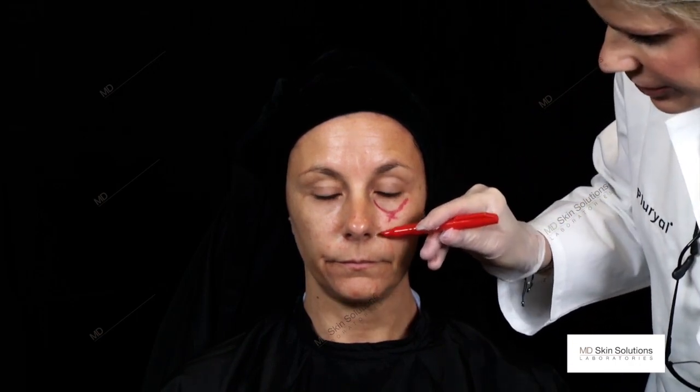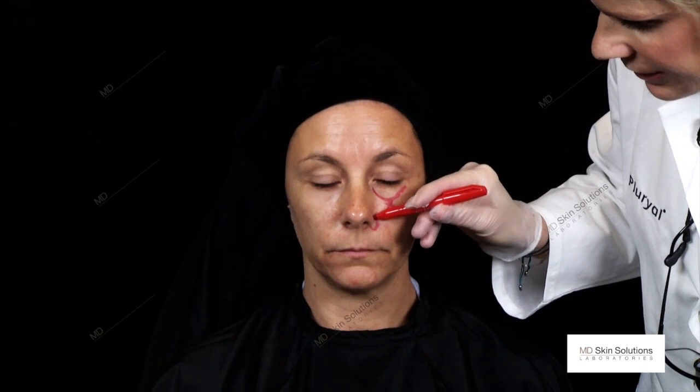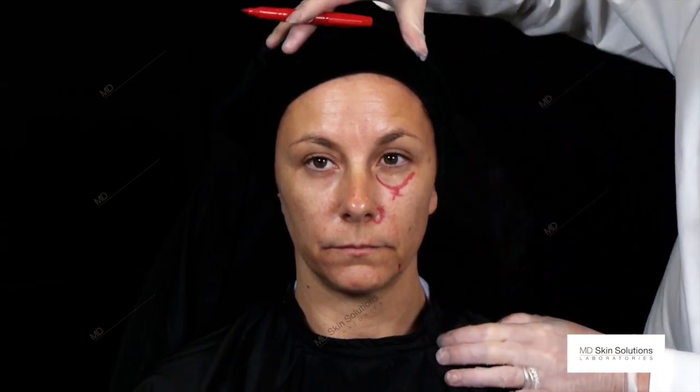A zone of danger obviously is the triangle here, as the facial artery runs along here. If ever we'd inject the whole lower face in her, the no-go zone is obviously the jowl.